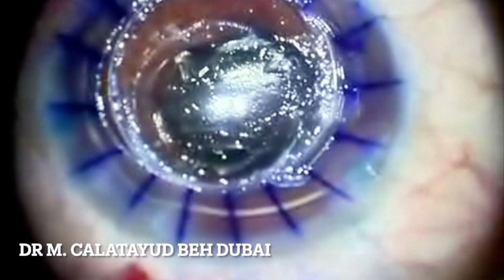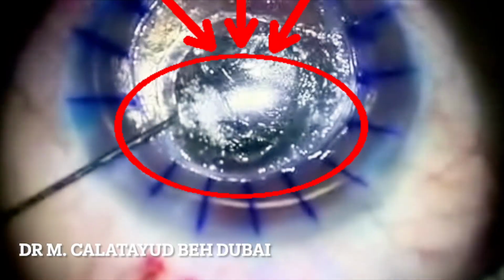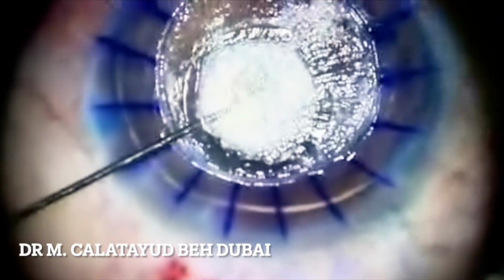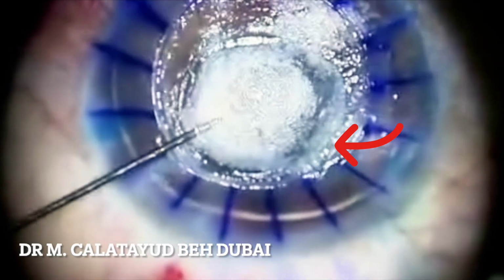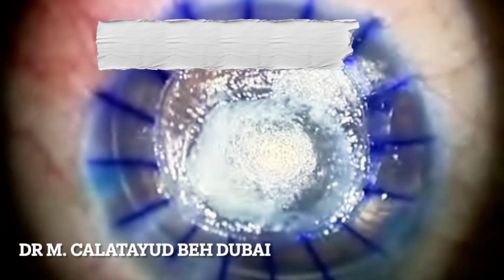I like to fill the anterior chamber with air, keeping the eye soft. Removing HPMC remnants from the dome will help to locate the place where the ring was placed. As we know, there is at least 200 microns in the stroma, so we use this area to inject the air with a 30G needle beveled down.